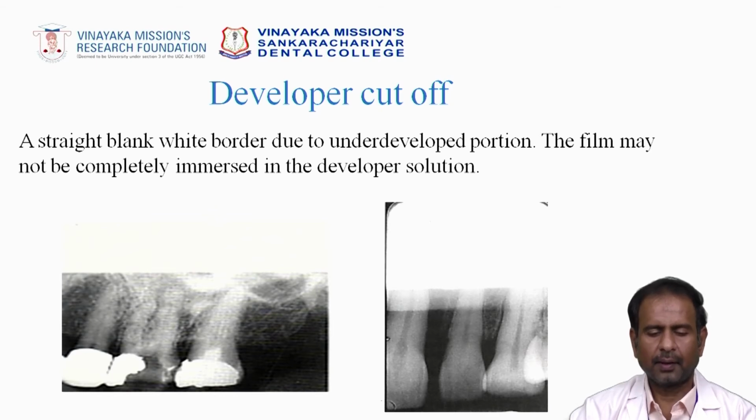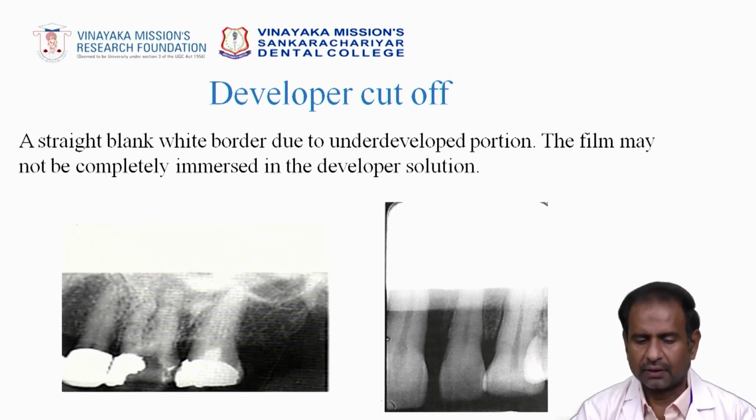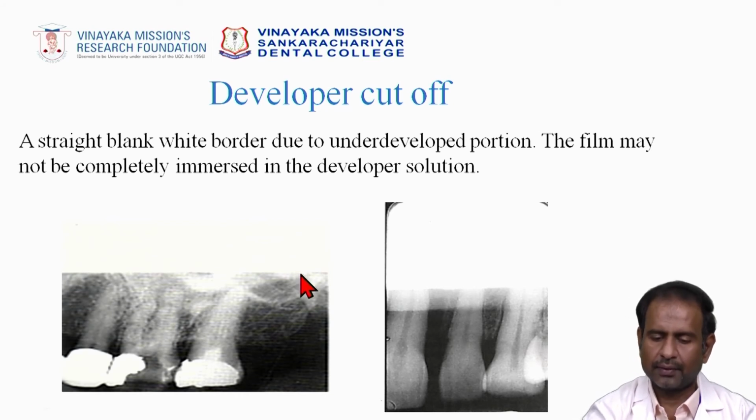The film may not be completely immersed deep into the developing solution. The part of the film that is not immersed in the developing solution has a white color appearance. That is the developer cutoff. Developer cutoff is white in color.